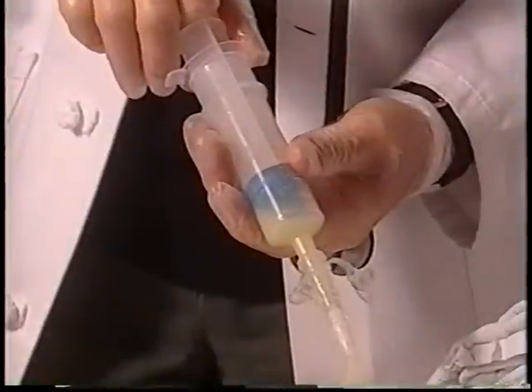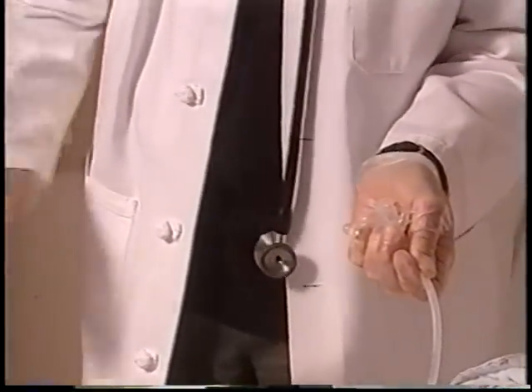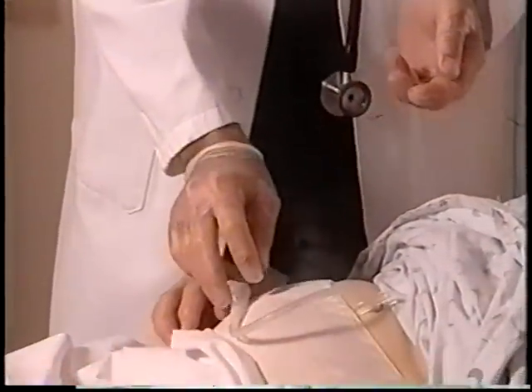High residuals may cause a backup of gastric contents through the tube. This may also be caused by a failure to properly close the ports on the tubing. Again, residuals should be monitored and all connections within the system checked for security.